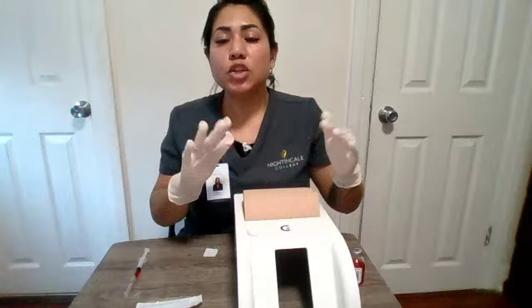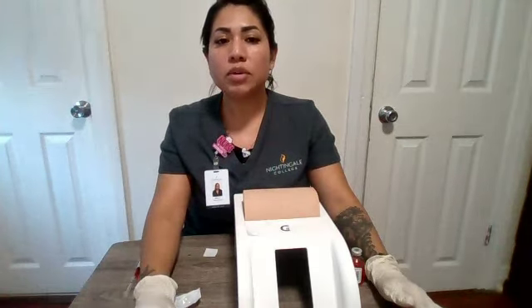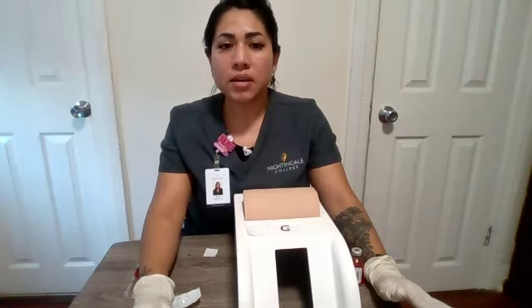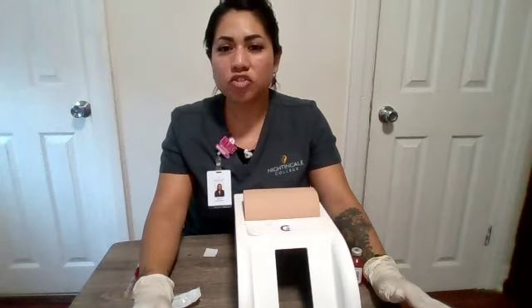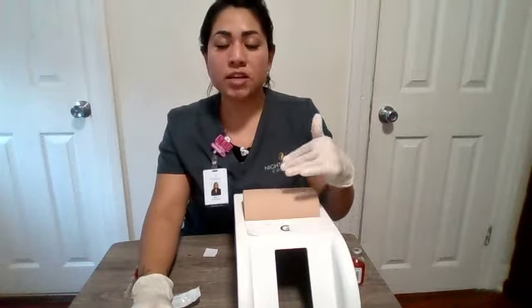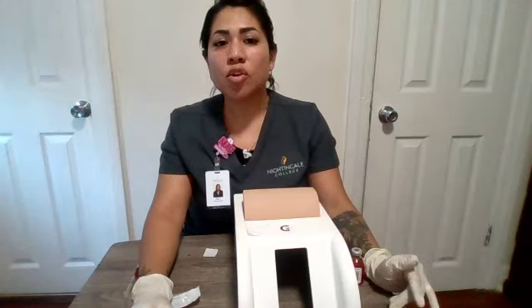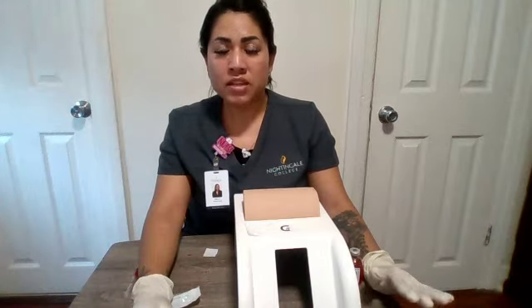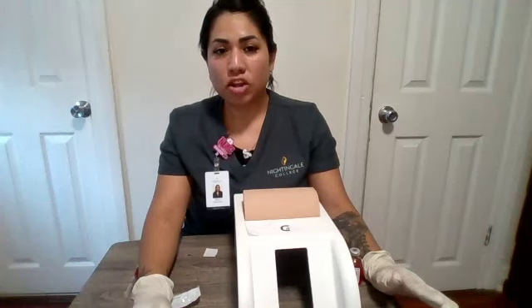Okay. So before I administer the medication, I will need to make sure that I assess my patient's skin. So I will be noting the skin integrity and the size of the muscle. I will also assess for any bruising, skin irritation, or edema on the skin, and make sure that he hasn't had a recent injection on that site. I will also palpate for tenderness or hardness. And if I notice any irregularities, I will avoid these areas and rotate the site if my patient receives frequent injections.